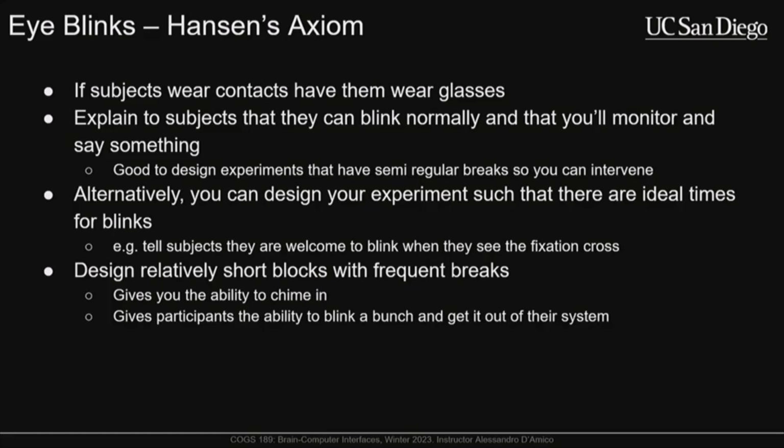So can artifacts be generated by people intentionally trying to stop blinking? Are you thinking of a situation where somebody is doing a staring contest, just holding their eyes open? That does happen, and you'll see it as higher frequency muscle noise in the electrodes from the forehead up, like FP1 and FP2. You'll start seeing these very high frequency muscle signals if participants start off calm and then try to keep their eyes open, really expanding their eyes out. That is why we give them the instruction at the beginning of the experiment that they should blink normally. We'll let you know if you're blinking too often, because you don't want to put them in that situation.